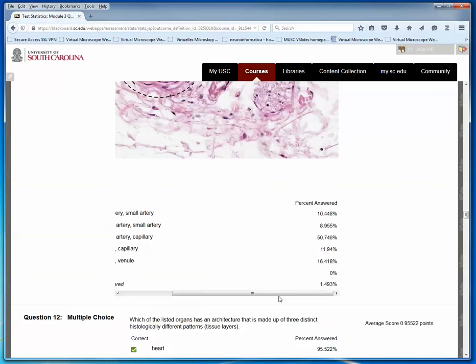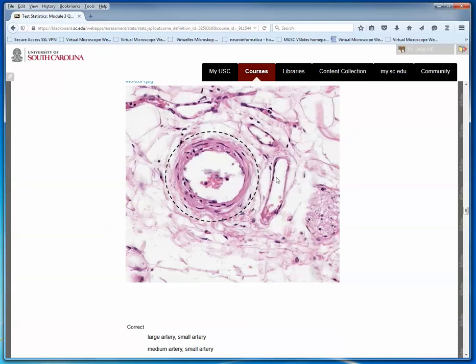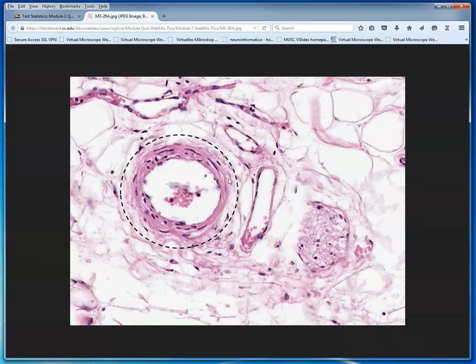And this vessel is an arteriole. See, here's a venule, very thin wall, but this vessel has smooth muscle in it. You could have enlarged this and see very clearly the pink staining, and you see the flattened long nuclei compared to the short flat nuclei of the endothelial cells. It has about 3 layers of smooth muscle cells, and it's quite dilated, and it's an arteriole.